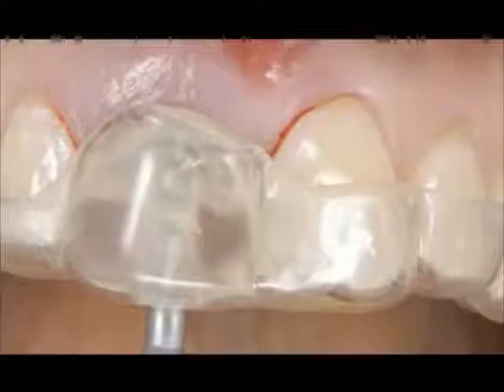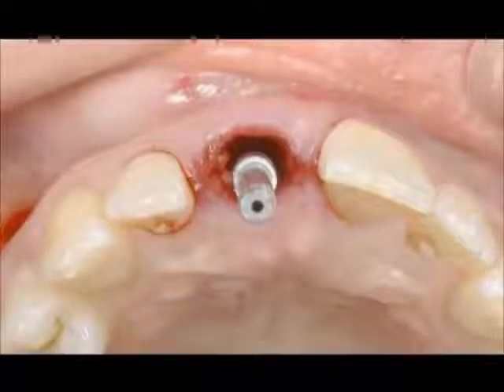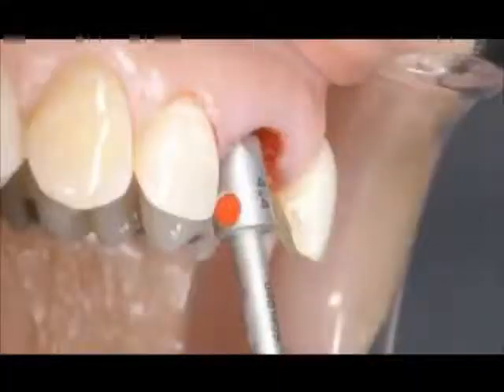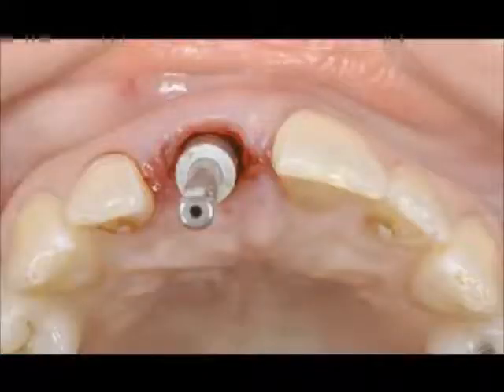And then utilizing a surgical guide to place the implant according to the CT scan 3D treatment plan that was done, so that the screw axis would be towards the lingual and we'd stay away from the buccal plate by approximately 1.5 to 2 millimeters. That jumping distance allows for bone ingrowth, and we know this from the literature that it has a high rate of success. I'm placing in this case a Zimmer tapered screw vent implant.